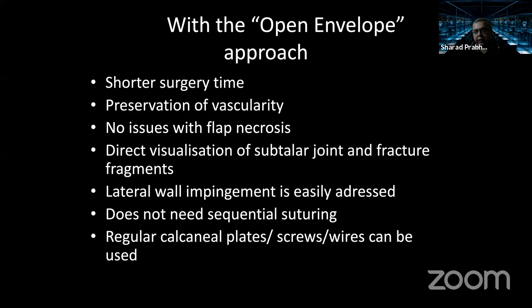As we have evolved, it has a learning curve. We now have a shorter surgery time. We preserve vascularity. There is no angled flap, so there's no flap necrosis. You can directly see your fragments. Lateral wall impingement can be addressed. You do not need sequential suturing.